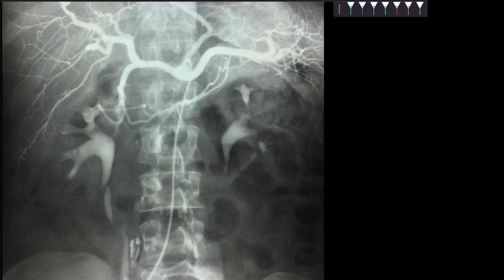Right now I am showing you this procedure and doing the interpretation for the celiac artery. We have inserted a catheter which has gone all the way up — let me make it a little bigger so you can see it very clearly.